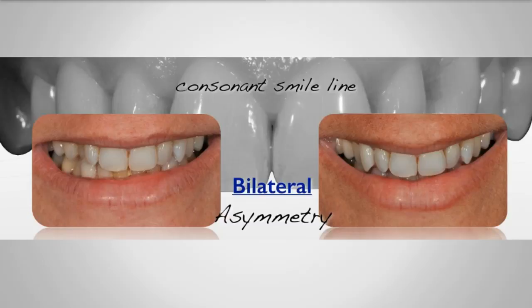And look, I really worked with my orthodontist closely. I really don't think it was indicated. Shouldn't say it's not indicated. I'm happy letting the patient have her own way. She has no symptoms of TMJ problems, no muscular tightness. What I'm trying to do by creating a bilateral asymmetry, in other words, I'm trying to create the asymmetry that she has on this side, and by doing so, we're getting balance.